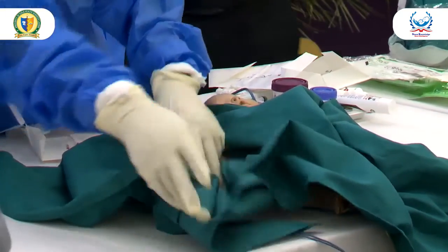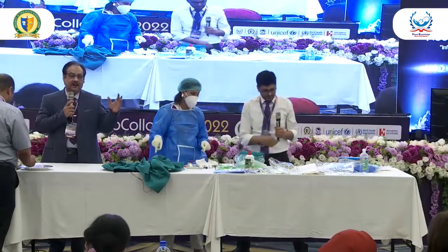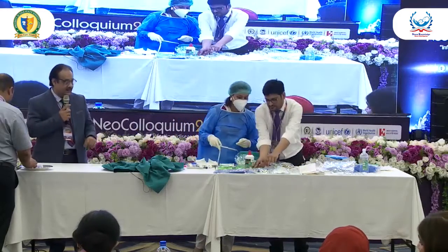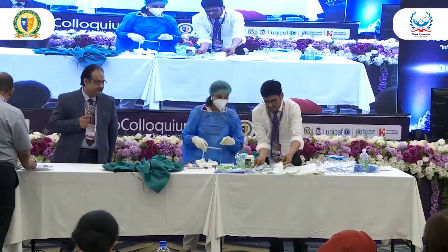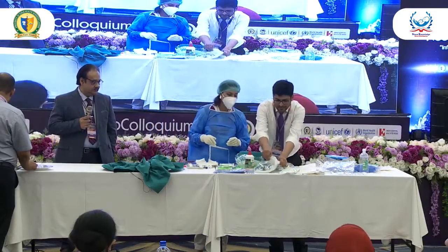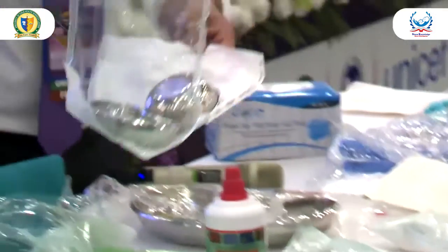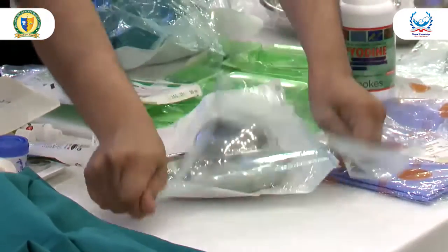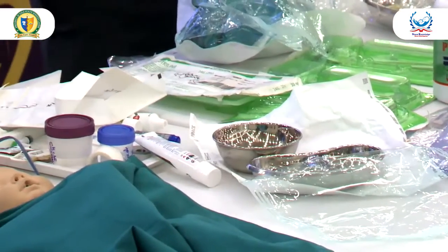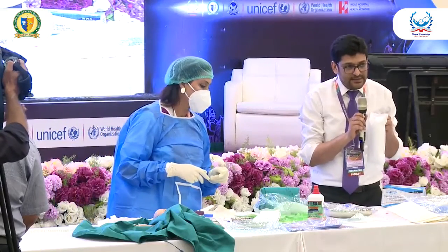In addition to that, never cover the face of the baby, whatever the reason is. Okay. The babies are nose breathers. So never cover the nose of the baby. Okay. Now we are about to clean the site of insertion with antiseptic solution.